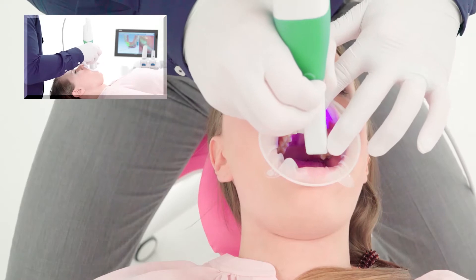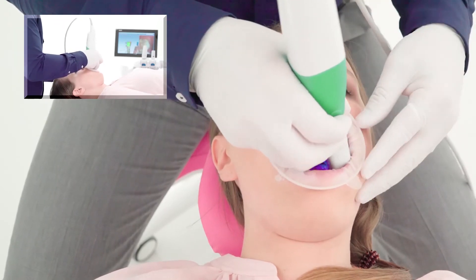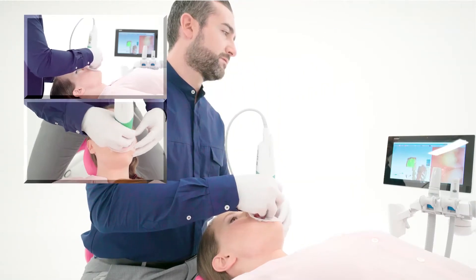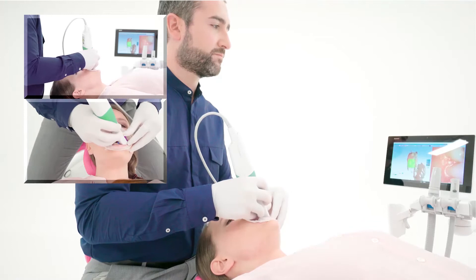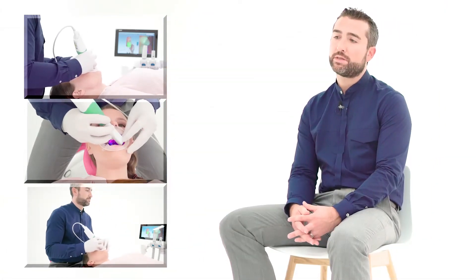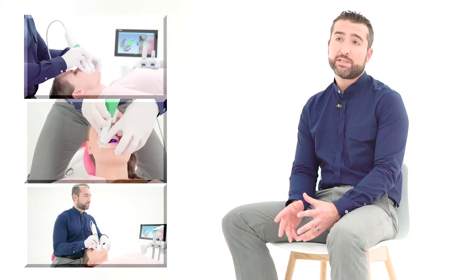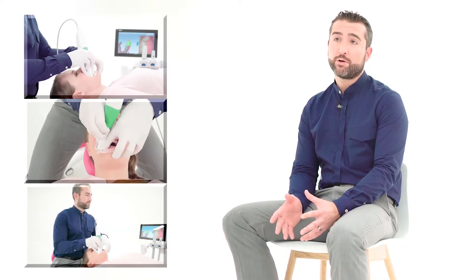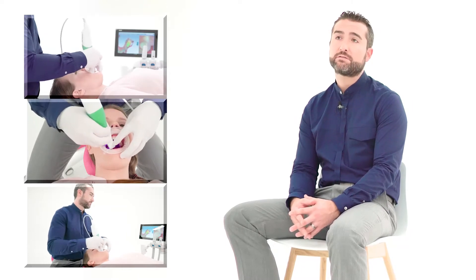It flows and moves in the mouth unlike any other scanner I've had the privilege to use. Speed is extremely important with patients staying open. A scanner five years ago took 12 to 15 minutes to scan upper and lower arch and a bite — that's a remarkable amount of time for patients to remain open.